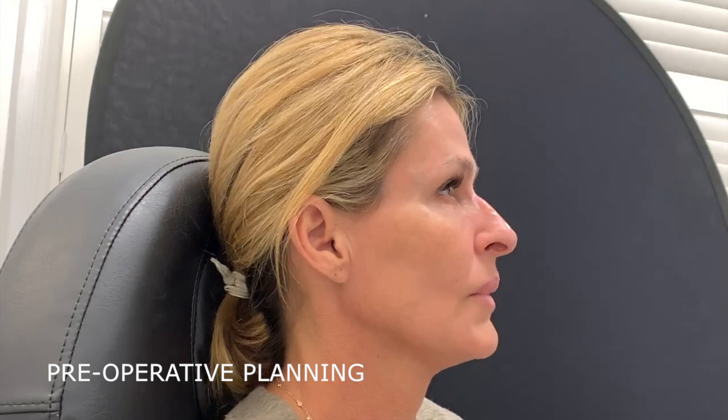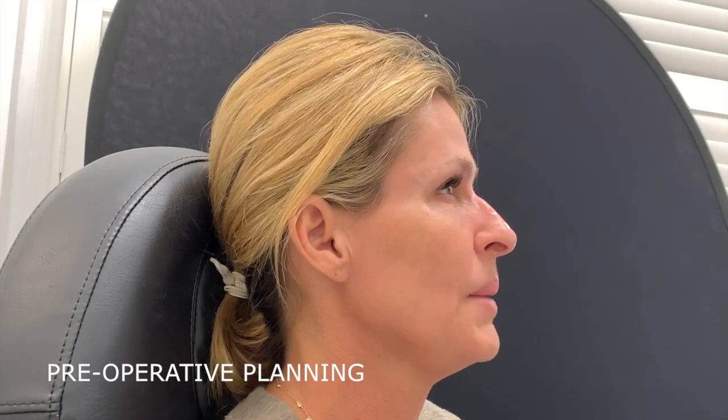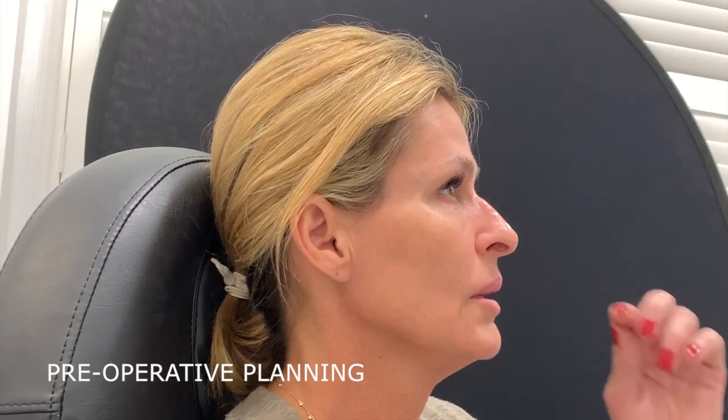After analyzing the patient, I obtain an appropriate informed consent in which I discuss explicitly with the patient serious but rare risks, including tissue necrosis and blindness. My medical assistant takes standardized medical photographs in 6 views, and topical numbing and sterilization of the nose is performed.